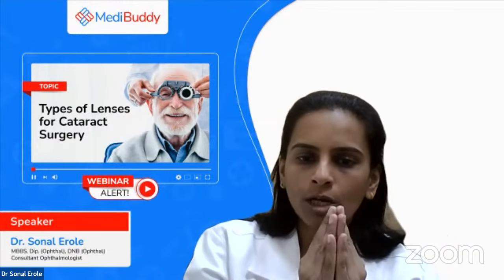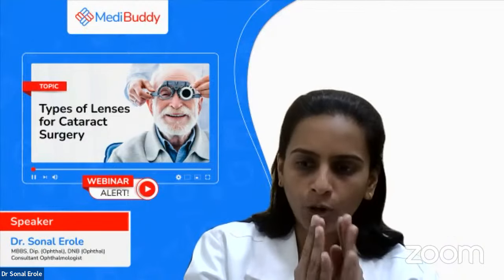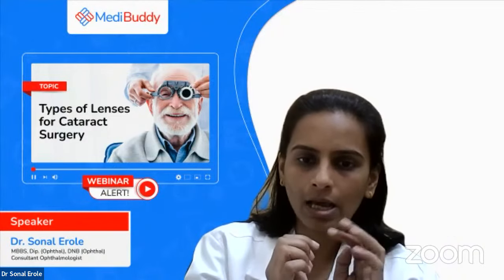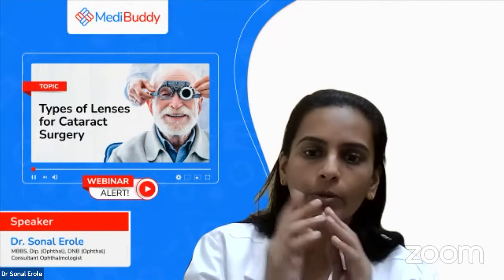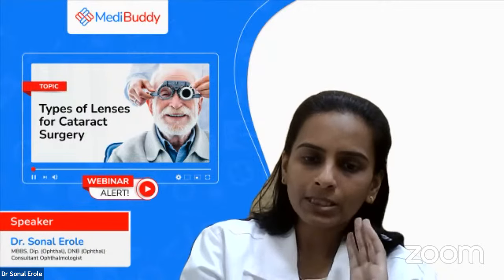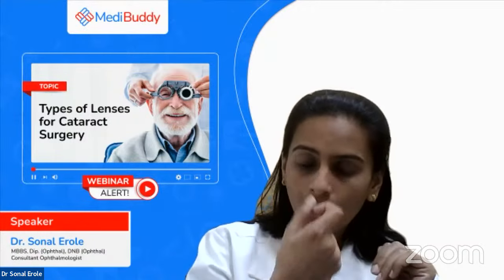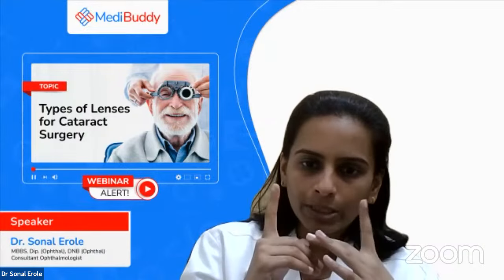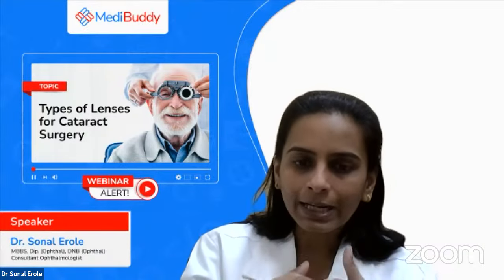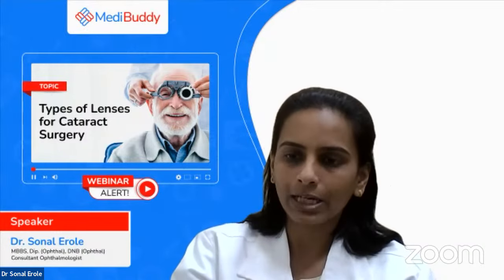And if you are operating on one eye, then whatever problems or functionalities there are will affect the operated eye only. The depth perception concept comes with multifocal lenses. If you are using multifocal lenses in both eyes, then near vision is best for that patient.